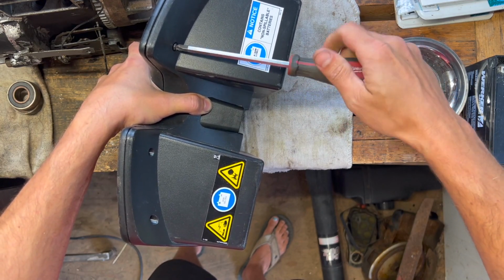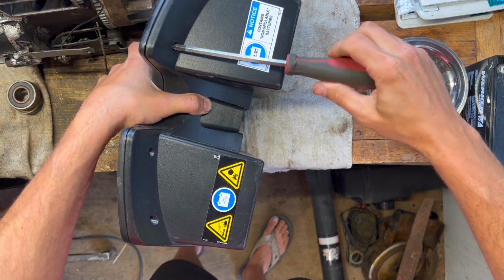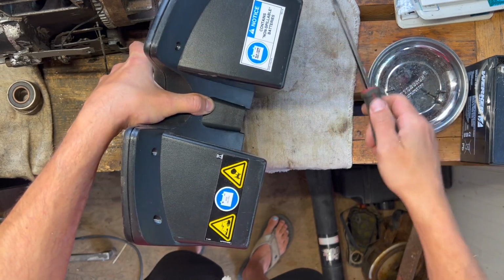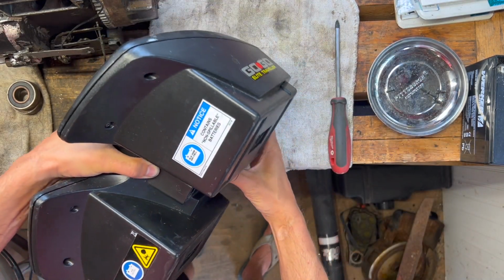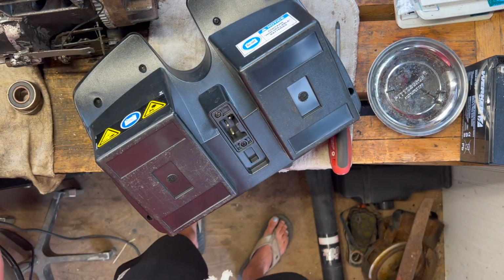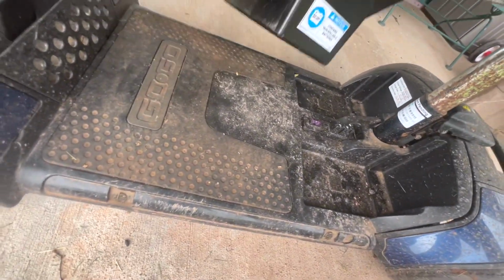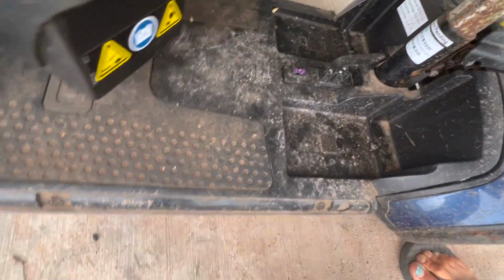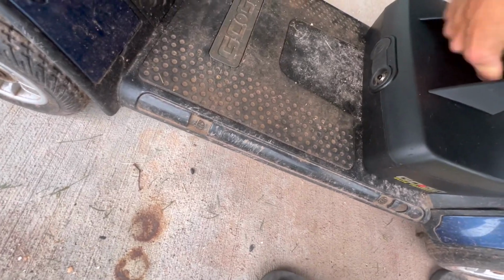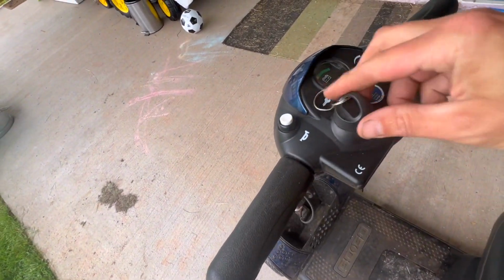There's only a handful of screws, and I think there were maybe 2 that were missing. So I'll see if I can find some replacements. We'll get this all buttoned together and put it on the machine. Alright, I think this just slides right into the base here. There's nothing holding it. Just kind of clips in there. And we turn it on.